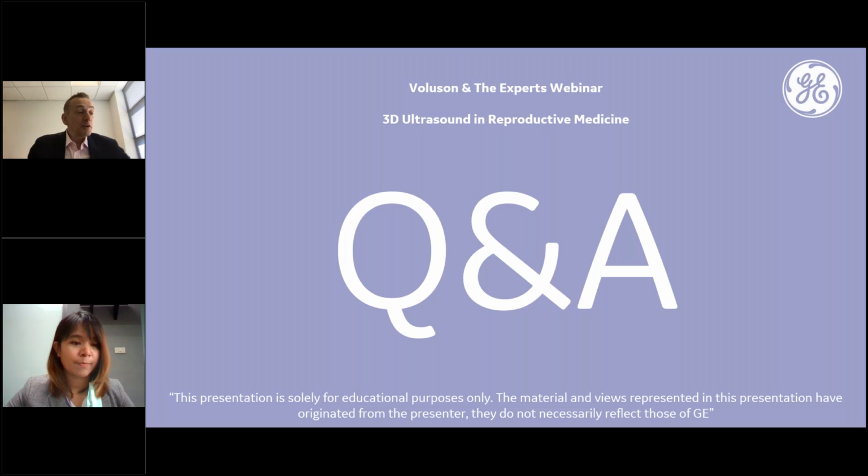Yeah, again, a very good question. These are excellent questions. I shall write them down actually and make sure I put them in my next presentation. So thank you for that. So yeah, we see a lot of these myometrial cysts. What I would say is, I think if we put the other signs of adenomyosis together, so we have echogenic lesions, subendometrial myometrial cysts, and this shadowing. I think when you scan patients often who are completely healthy, have no problems, and you see these small cysts, and you do see sometimes hyperechogenic nodules, I have to say I personally ignore them.